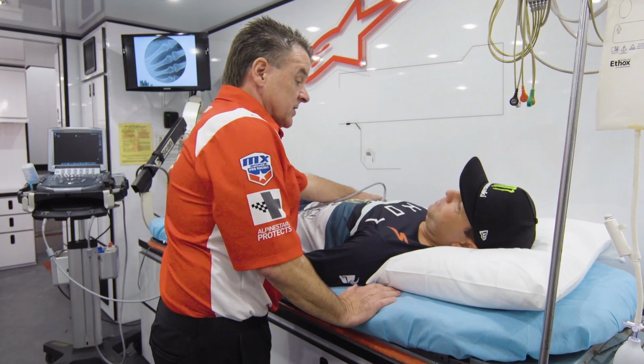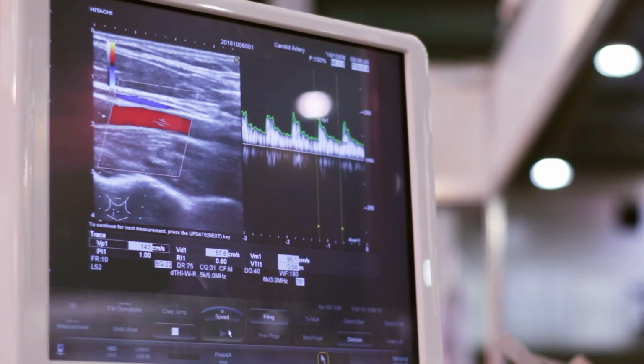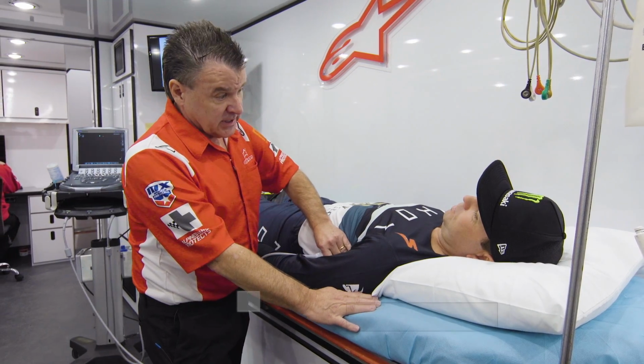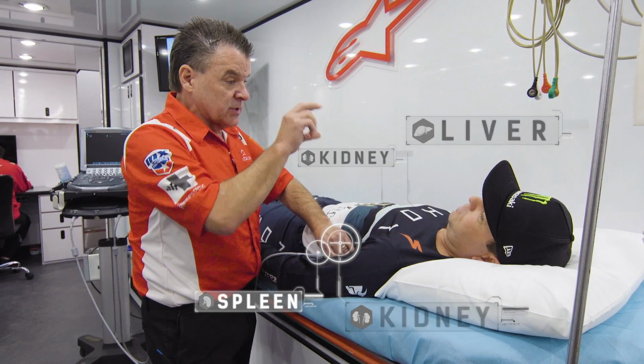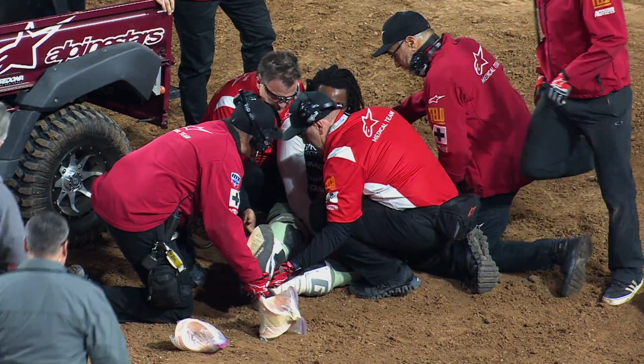From this view, I can see your liver, and I can see the kidney behind the liver and the lining of the lung next to that. If there's something that looks like a black area, that means you're probably bleeding around that area. Same thing on this side, I would look at your spleen, look at the kidney underneath that. As long as I don't see any black streaks and everything's nice and tight in there, we know you're not bleeding. What can you do here for a broken bone?